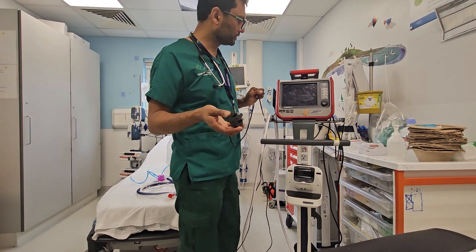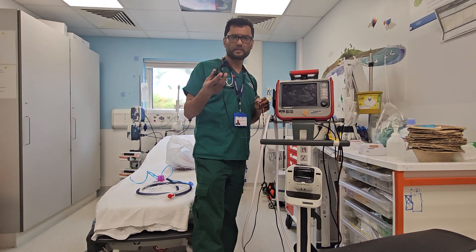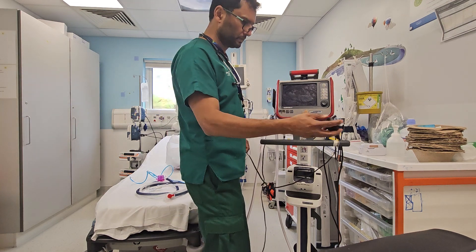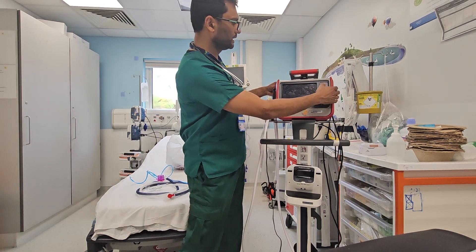Good morning. We are learning how to use the Hamilton T1 ventilator, which is replacing the BB pack. It's simple to use. It has an inbuilt battery, but it's better to plug it in. Otherwise it will run on battery, and then we switch it on.